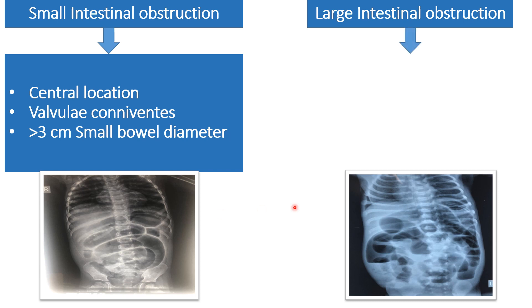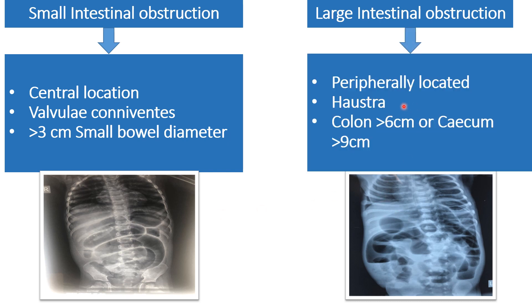In large intestine obstruction, the dilated bowel loops will be present in the periphery of the abdomen as well. As in this X-ray, you can see in the periphery there are dilated bowel loops with air-fluid levels, and haustra will be visible throughout the colon. Whenever the diameter is more than 6 cm for the colon, it is pathological. For the cecal part, more than 9 cm is considered pathological.